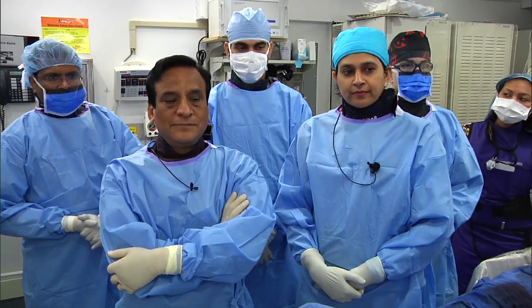Samin, superb case. I thought it was a very practical and useful demonstration of inserting of the Impella, and just a brilliant use of rotational ablation. The decision pathways to undersize to the 1.25 burr, to persist with it, to eliminate the wire bias, to increase the speed. Excellent illustration, Anu. Final points from you, and I'd like to also know what are your plans for the LAD?